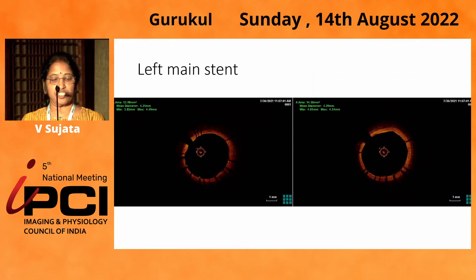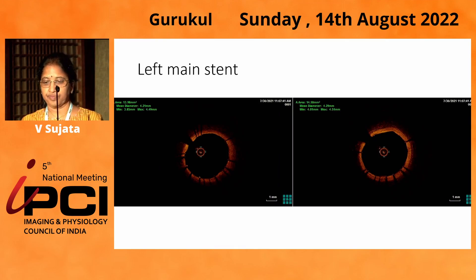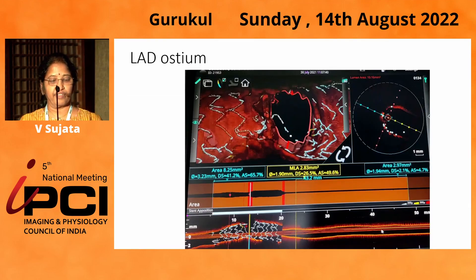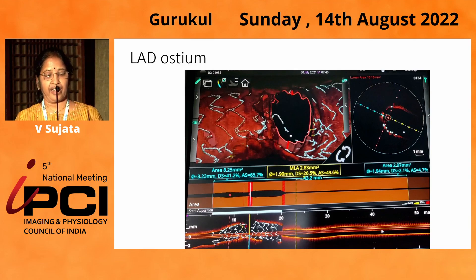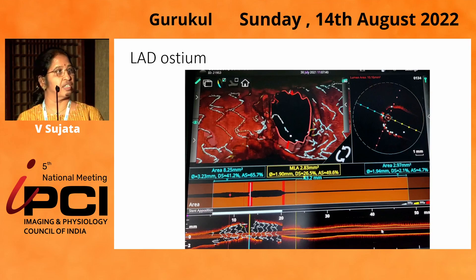As we come to the confluence, the area was 12.6, and the left main stent area was around 14 to 15 mm². We then looked at the struts across the LAD and found there were no struts across the LAD ostium.